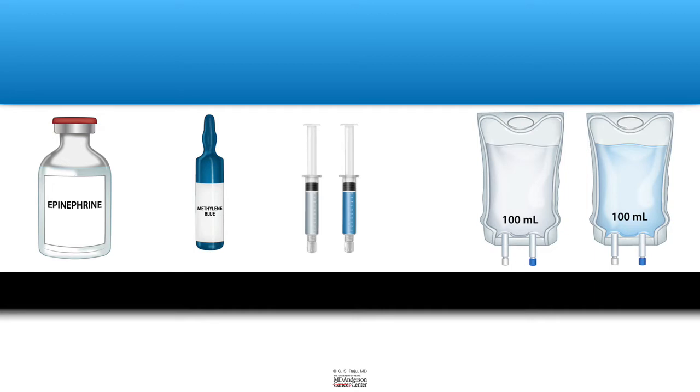In addition to methylene blue, some endoscopists may use a little bit of epinephrine, and that causes spasm of the blood vessels and cuts down the risk of bleeding during a polyp resection. Some use viscous solutions like hetastarch, and it all depends upon the endoscopist's preference. So you've learned that there are different solutions, but the commonest solution that is used is saline.